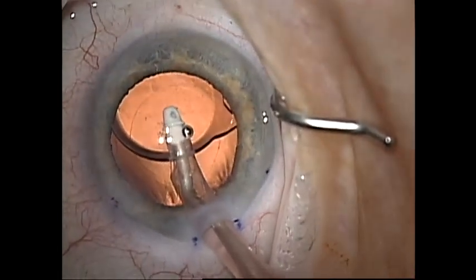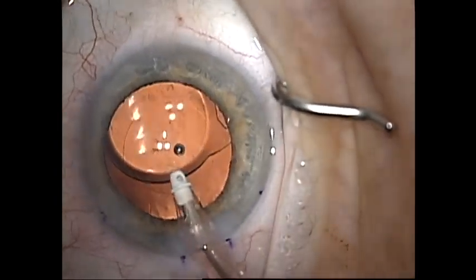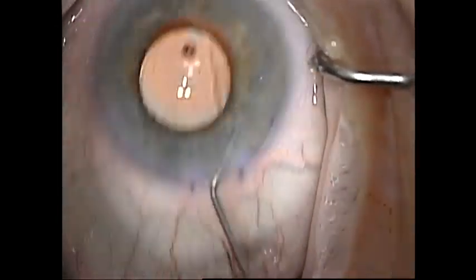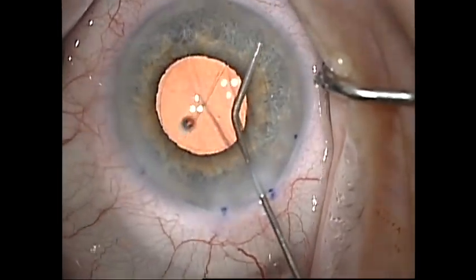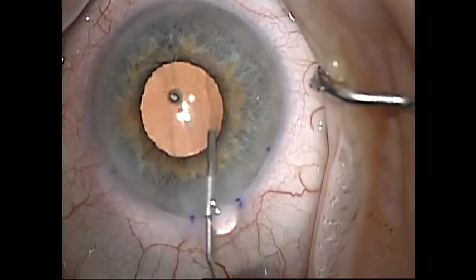After lens insertion I like to remove all of the viscoelastic from the eye so that I can achieve good pupillary constriction and know that there is no more viscoelastic behind the intraocular lens. Next I inject Miochol to bring the pupil down. I prefer Miochol to Miostat as its effects are shorter lasting and less likely to lead to posterior synechiae.